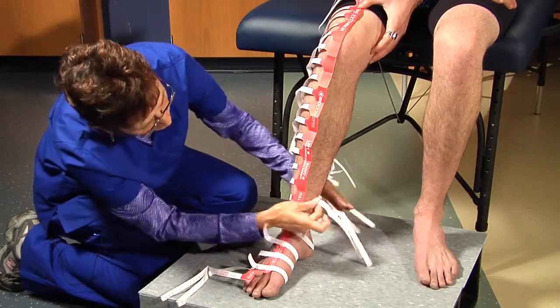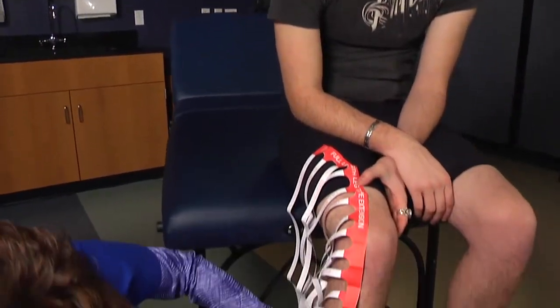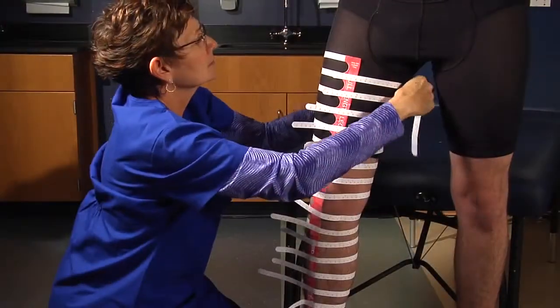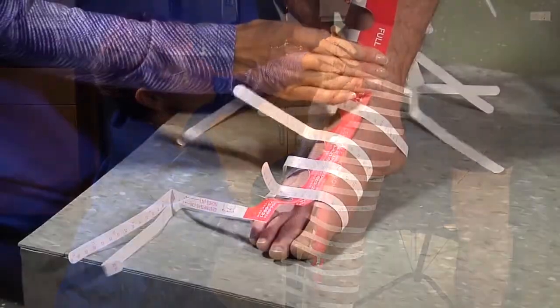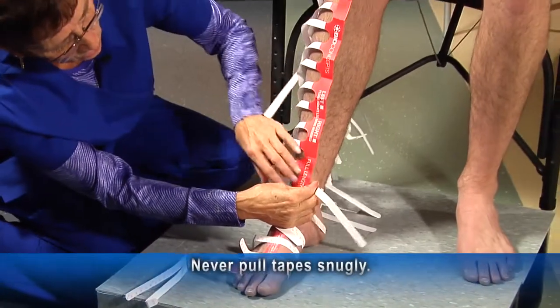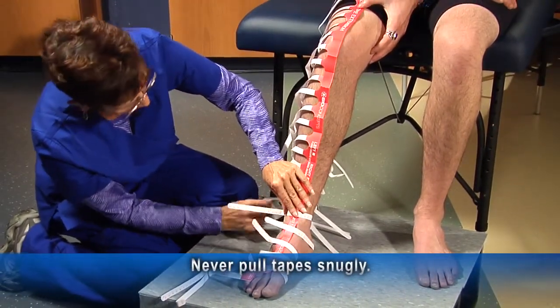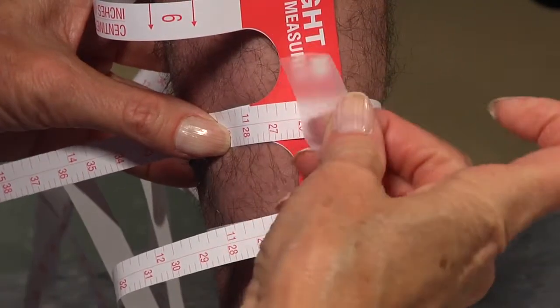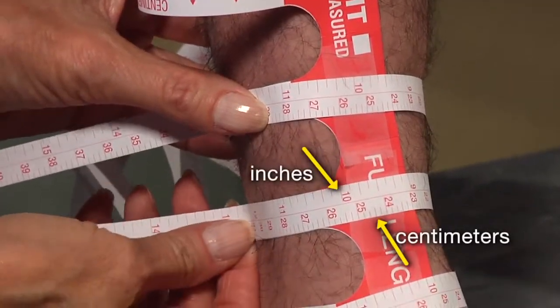Align the straight edge of the colored portion along the anterior midline of the foot and leg. Secure additional tapes around the calf and thigh, up the leg to point X, which is the fold of the buttocks. Record the circumferences by wrapping the tape around the leg at each of the one and a half inch intervals, beginning at the first leg tape one and a half inches above the ankle. When reading circumference measurements, always read the outside border of the paper tape.